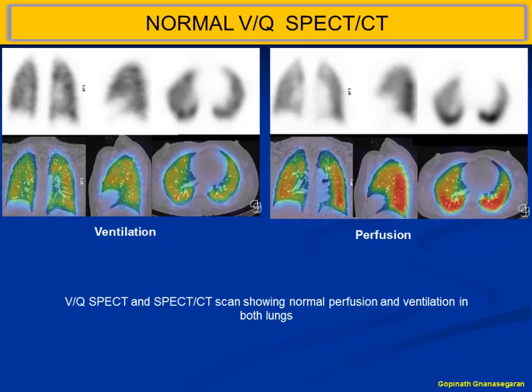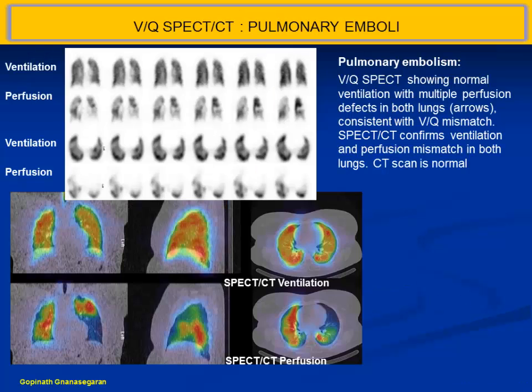But if you're doing a low dose CT, you can avoid the baseline chest X-ray and send the patient directly to VQ scan. But again, some people can argue, what if the chest X-ray is abnormal to start with, then you can avoid sending them to VQ scan, they can go directly to CTPA. So you can have a debate on that. But in our place now, all patients referred for a VQ scan except pregnancy will have a SPECT CT scan.